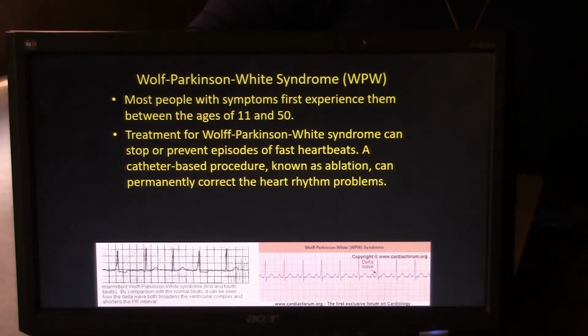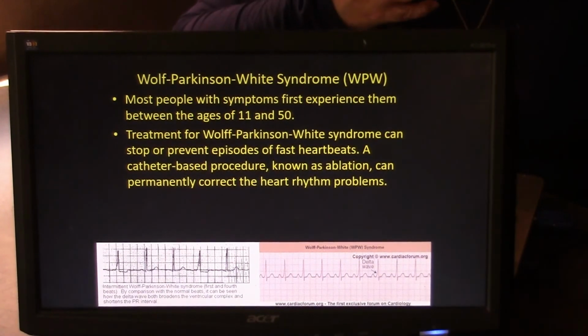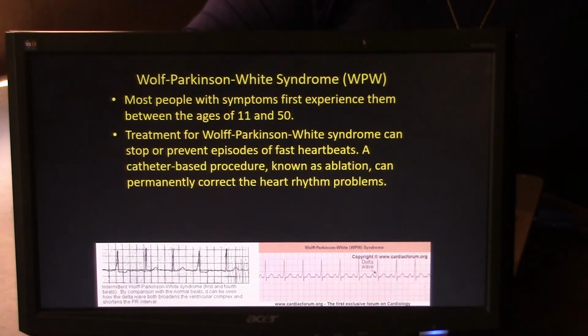If you bring the code card in the room, hook it up to the patient. Put the electrodes from the EKG machine to the patient, because you will not be able to cardiovert, or even pace, unless the leads from the machine are hooked directly to the patient. If the patient needs CPR, make sure you have the bed in CPR mode or the backboard under the patient. Remember, early interventions such as defibrillation and CPR can save a patient's life.